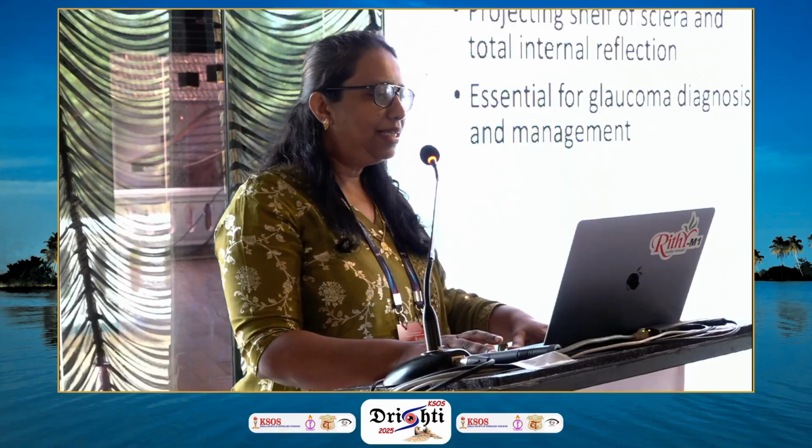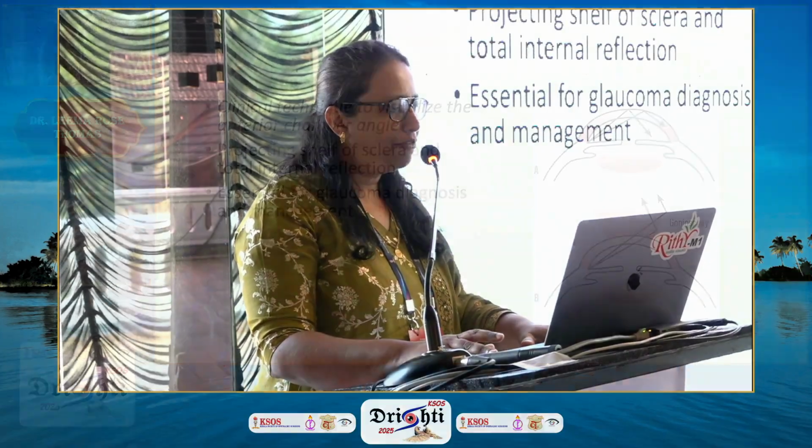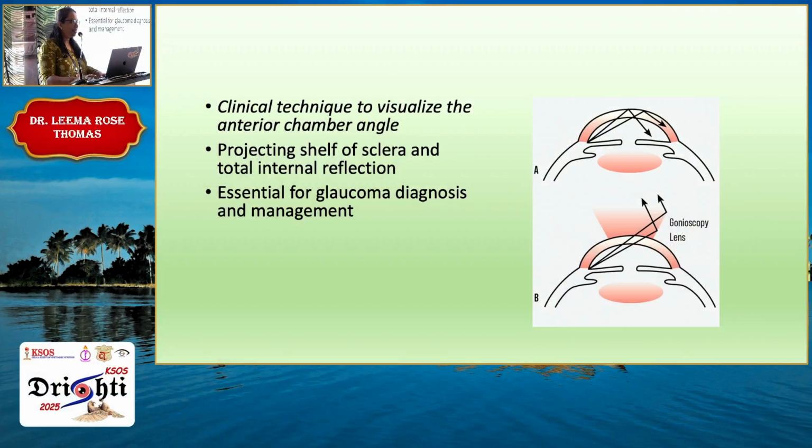Now, it's a clinical technique to visualize the anterior chamber angle. Because of the projecting shelf of the sclera and total internal reflection, we can't see the angle, and therefore we use a medium which changes the critical angle, and thereby you can visualize the angle. It's essential for glaucoma diagnosis and management.